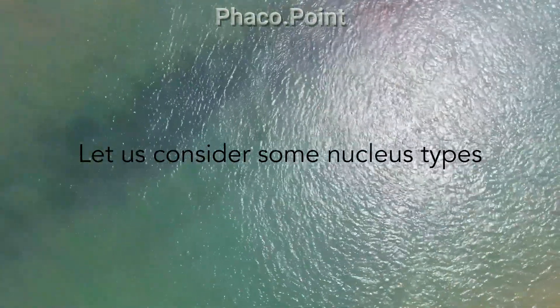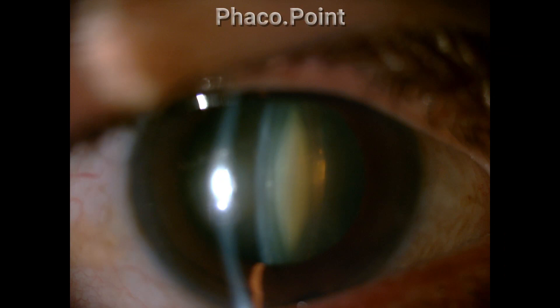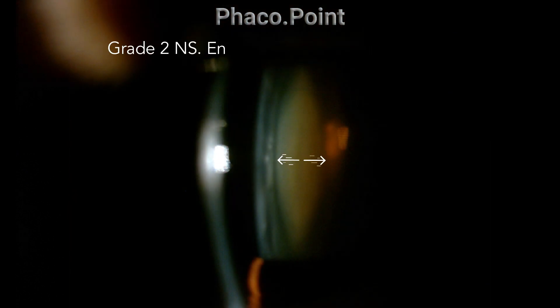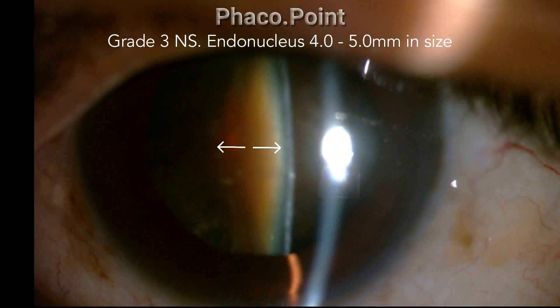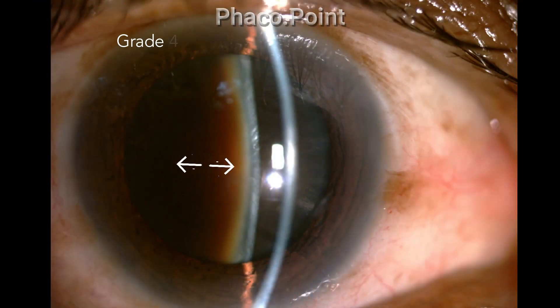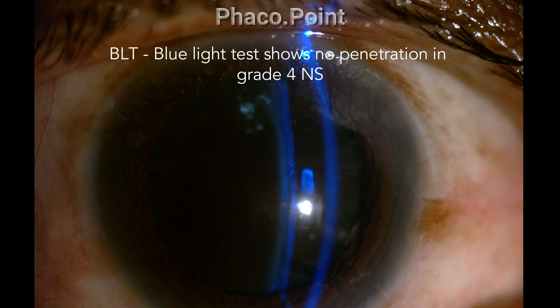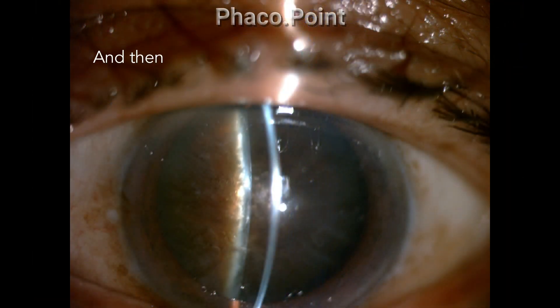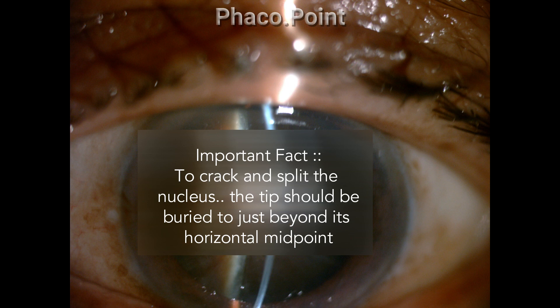In a grade 1 nucleus sclerotic cataract, the endonucleus is about one to two millimeters in size. In grade 2, the endonucleus is much larger at three to four millimeters. In grade 3, it is about four to five millimeters. In a grade 4 nucleus sclerotic cataract, the endonucleus is quite large — more than five millimeters. The blue light test helps grade the density of the cataract, and there are also grade 5 to 6 cataracts.